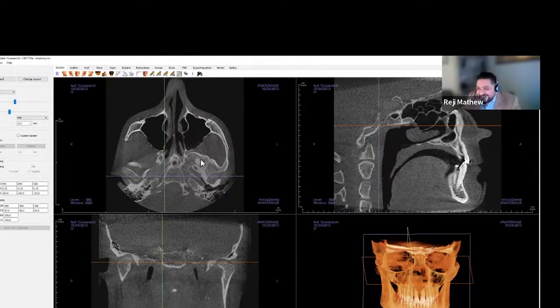Well, I'm going into that implant case next. Those are the things which we look for in sleep apnea. And here we have oral appliances. What it really does is move the mandible slightly forward and downward, creating a little more space for breathing.